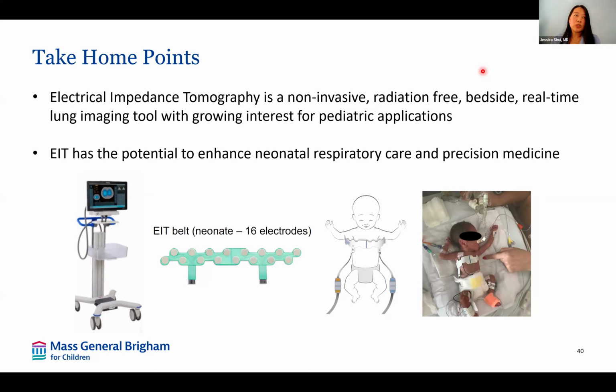And so we didn't use the automated PEEP titration tool from the adults. We were manually changing the PEEP after observing for around 20 minutes at a time just to watch for tolerance, because of our population with chronic lung disease and their heterogeneous amounts of compliance. We want to look for signs of relatively later atelectasis. That's why we had a slower PEEP titration compared to adults who could do it in minutes.